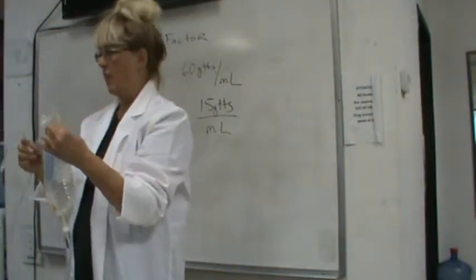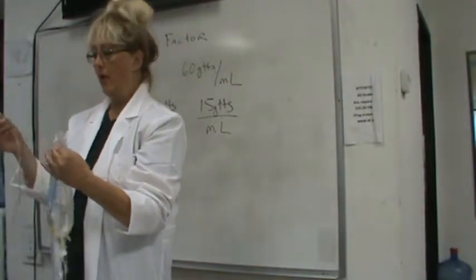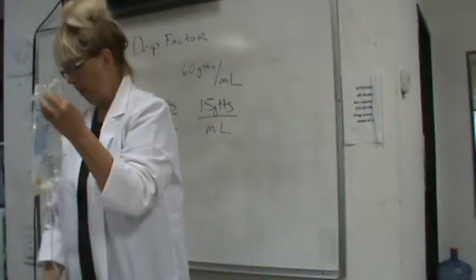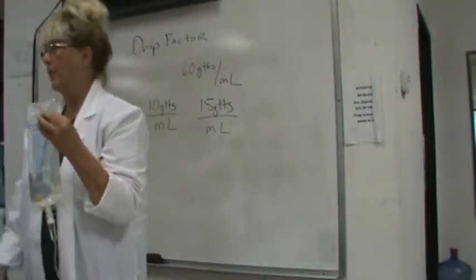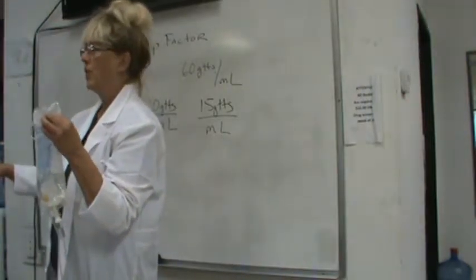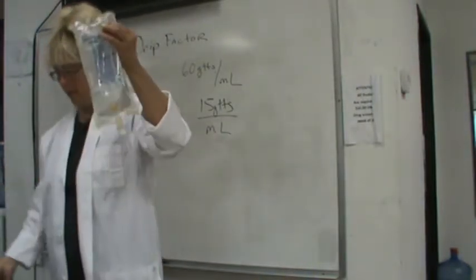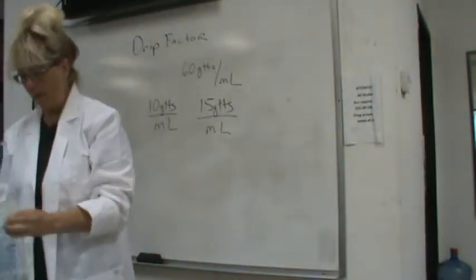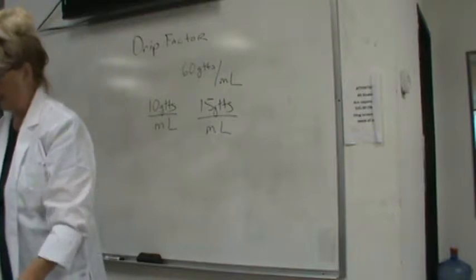So you guys did great. Good job. Now go ahead and lock this for now. Set it on your Chuck's pad. Leave it open. You don't want it full. You don't want to squeeze it. It shouldn't be full because you're going to have to calculate a drip rate in a minute. All right, set them down. Everything should be locked so they're not going to be leaking.